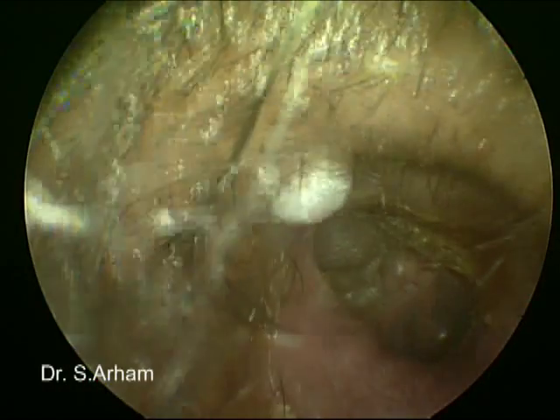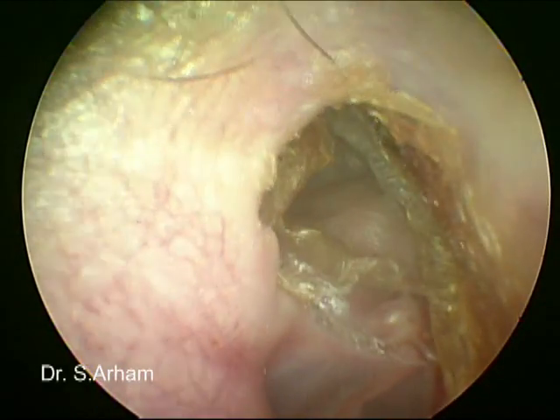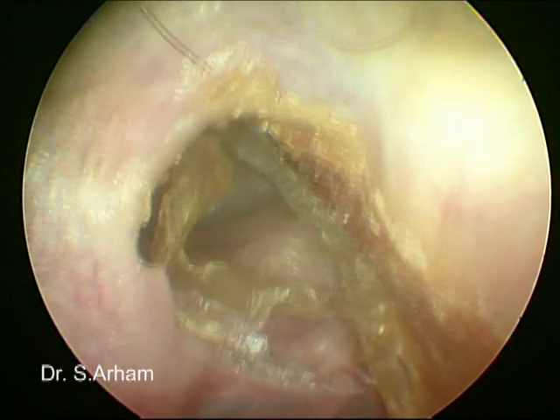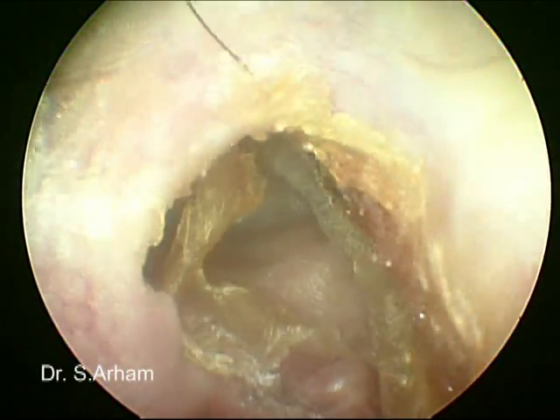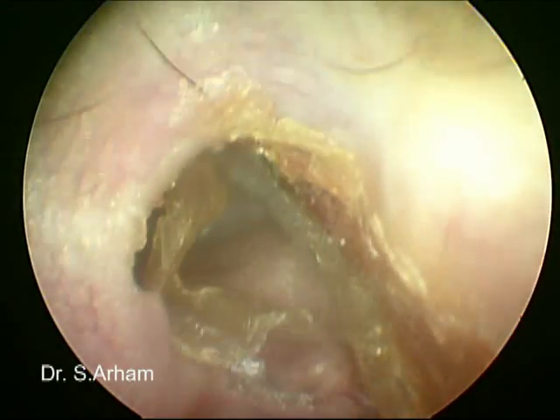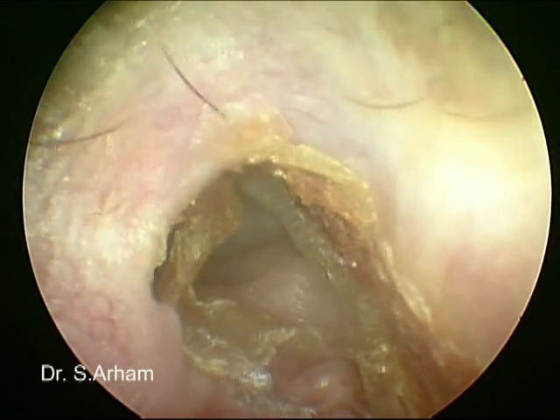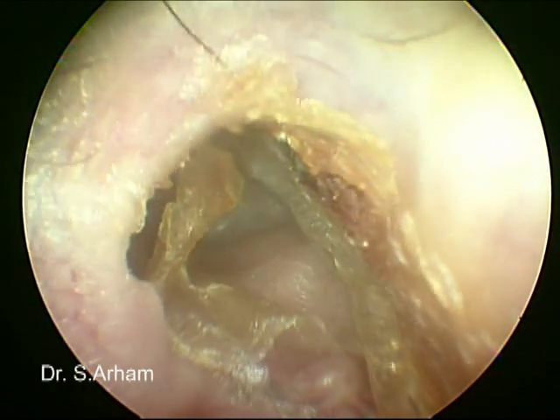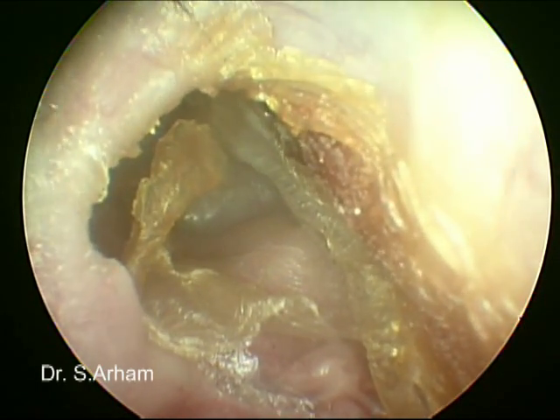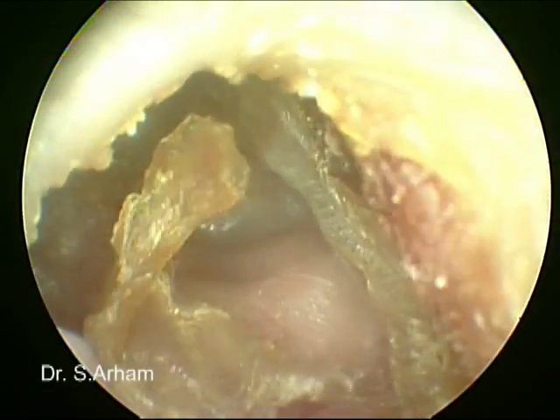There is a small white pearl in the canal. This is usually present when we are leaving a little bit of epithelial tissue — squamous epithelium beneath the skin. There is formation of a pearl as you can see in this canal. Then there is a nicely healed epithelialized cavity with little formation of some wax. You can see the wax in the canal, and this is a very nicely epithelialized healed cavity.